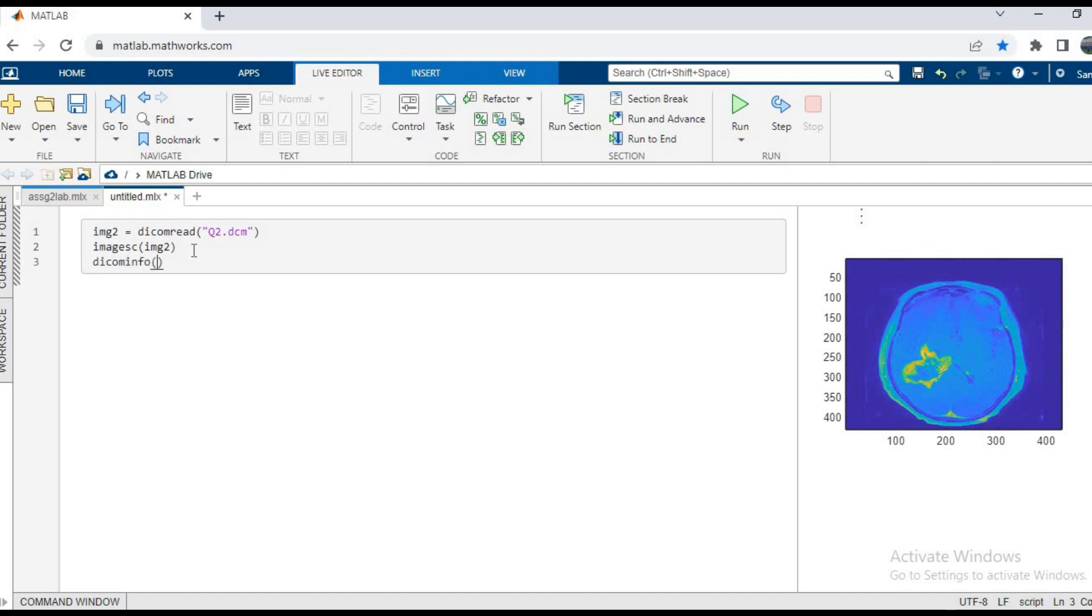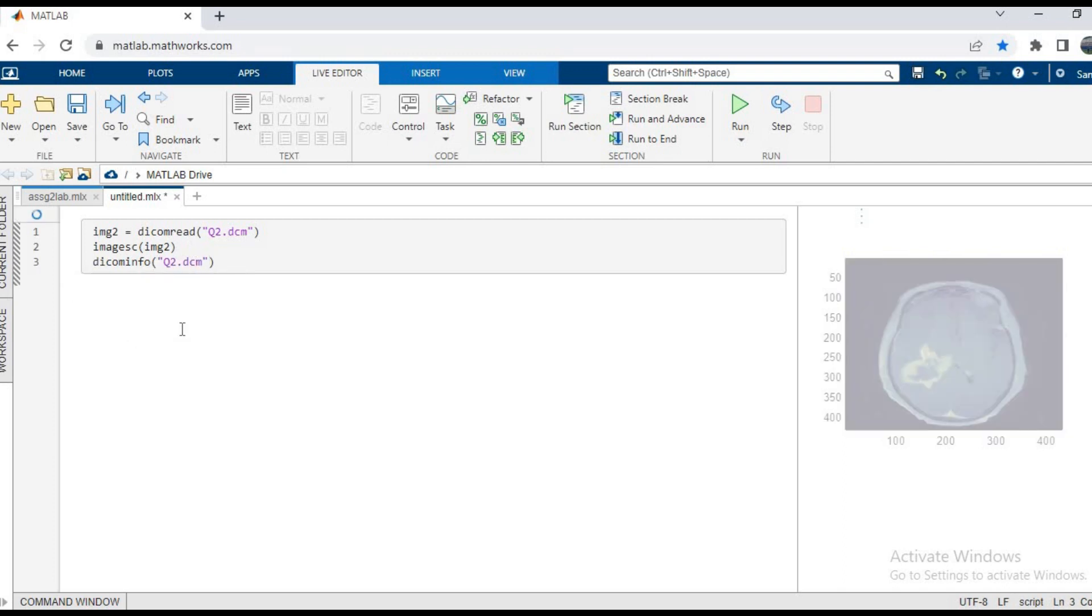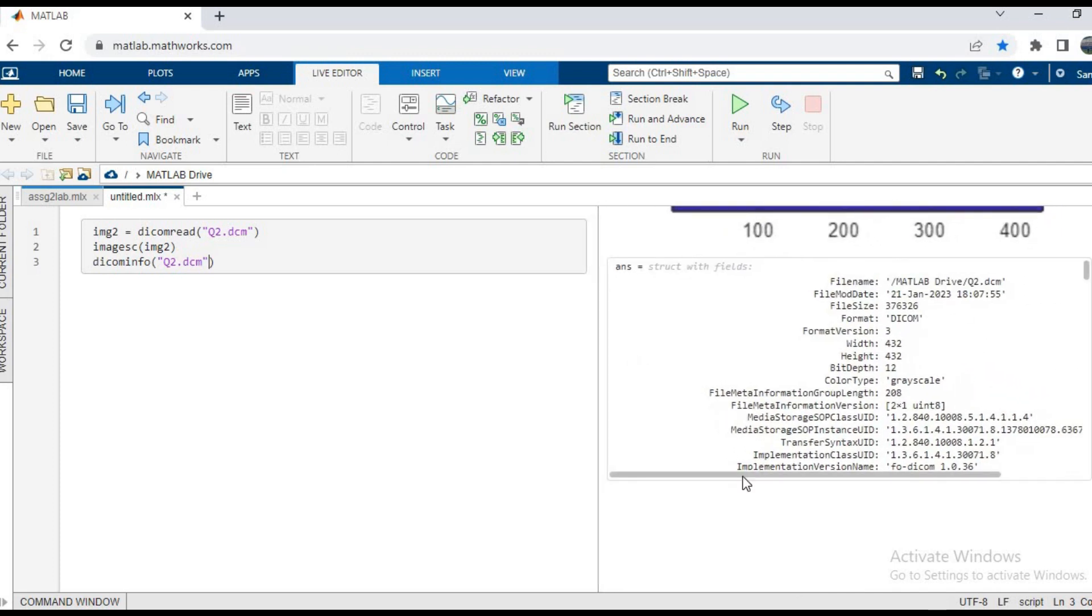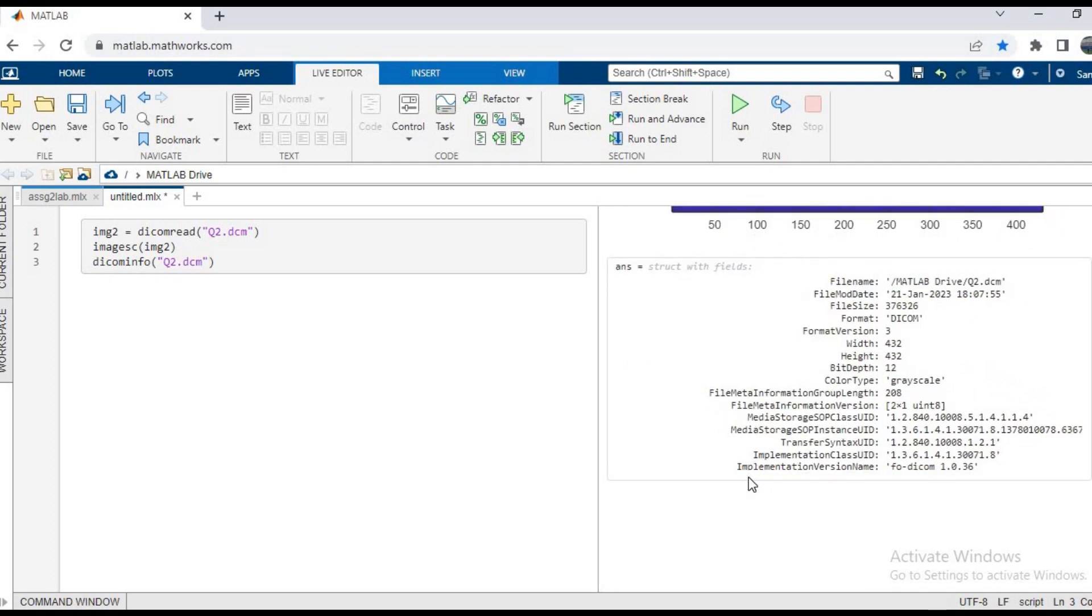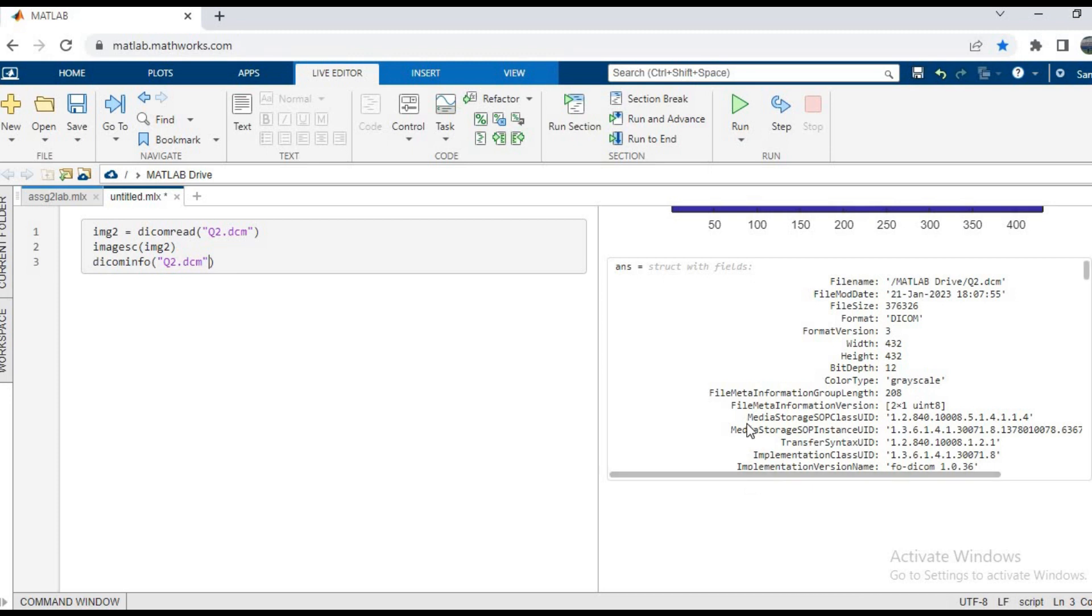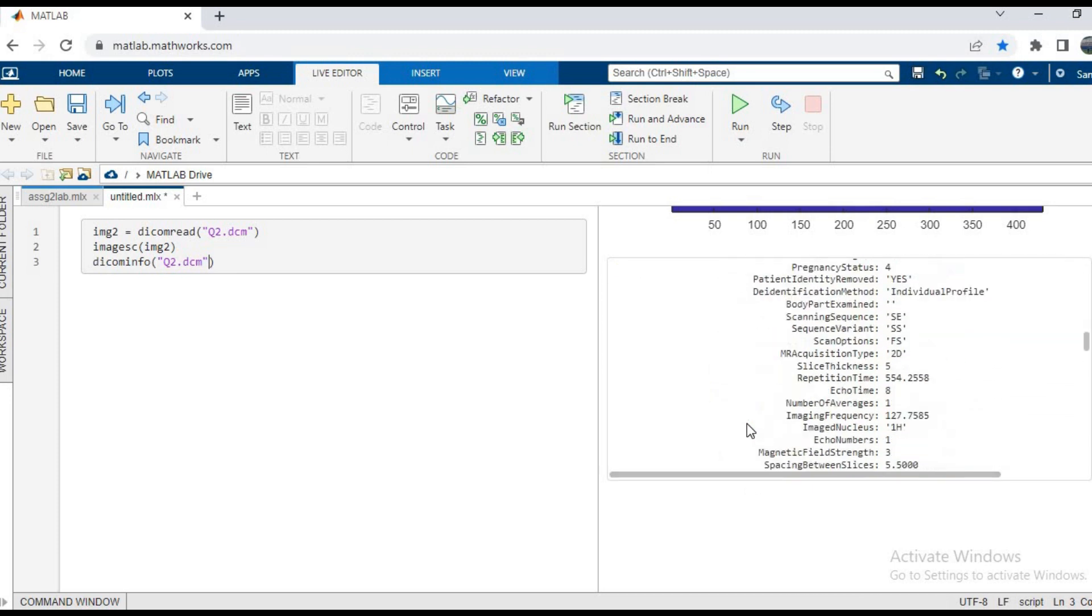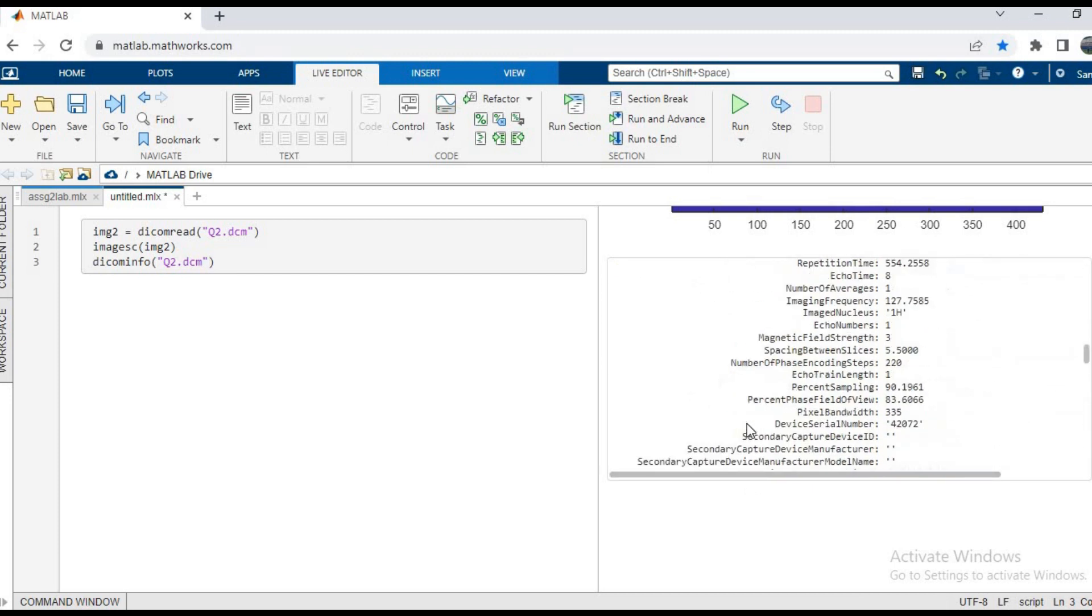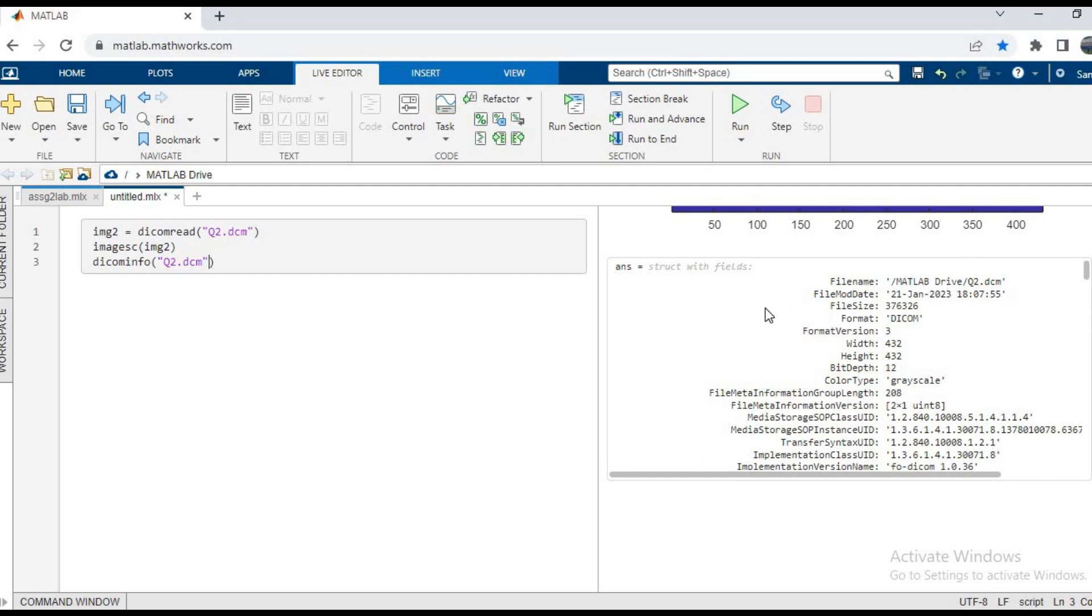And now we can see in the output area this is the output. So we can see the format, we can see different kinds of patient details, machine details, and the sequence details, date, and how it has been created. So basically, all the data which is related to the image, you can see in this one.